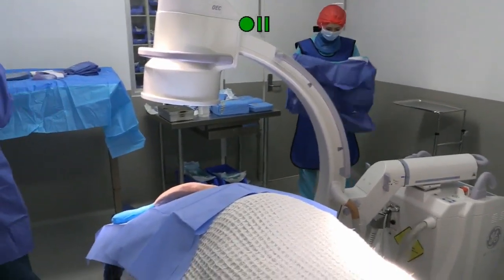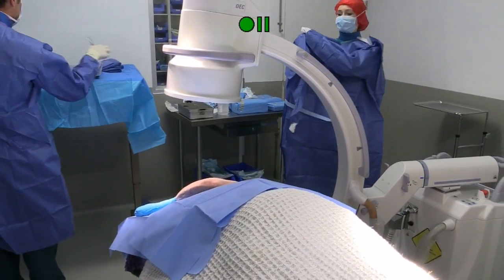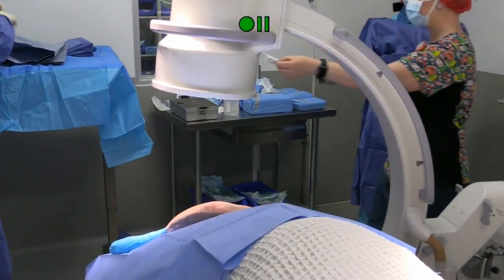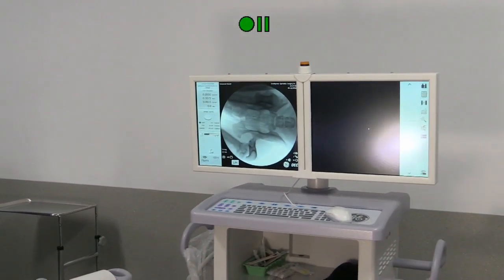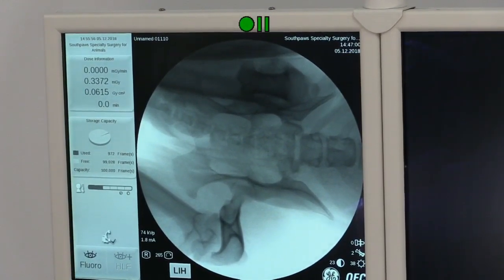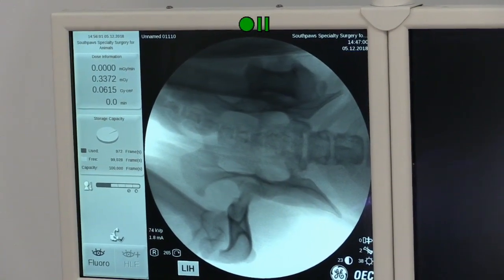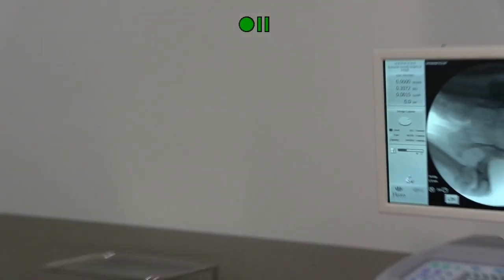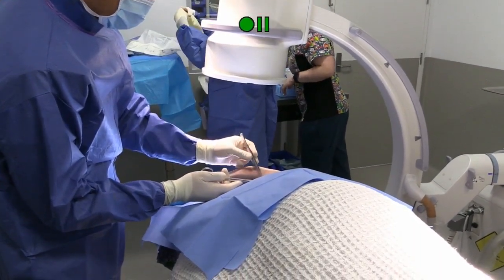All right, so the theater is all set up. We've got the patient here under drapes, and we've got the fluoroscope in the middle of the field here. I can zoom in a little bit more. Now when we come up over, you can see the fluoroscope over here. That's our first image that James has taken, and that's a craniocaudal view of the sacrum. And when we fluoro again, it's going to be a lateral view, similar to what you'd see on a lateral radiograph.